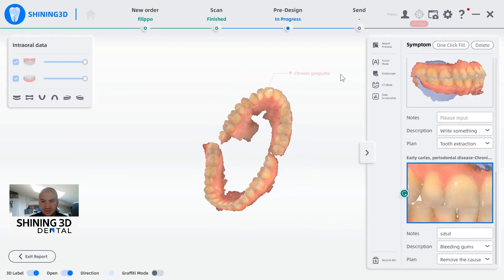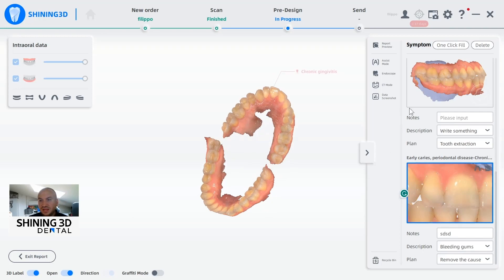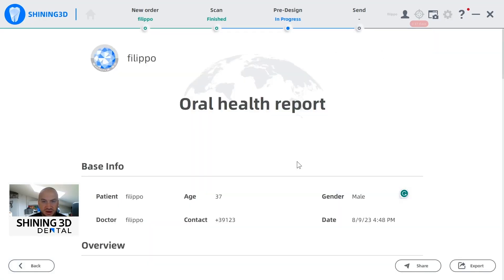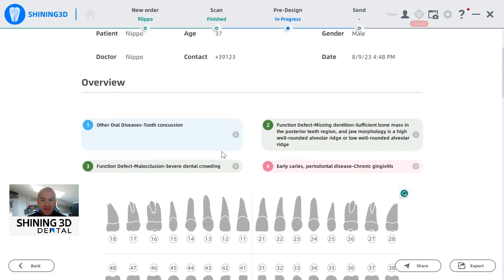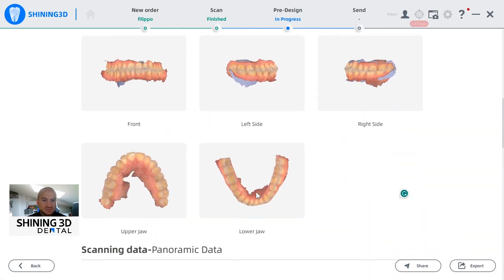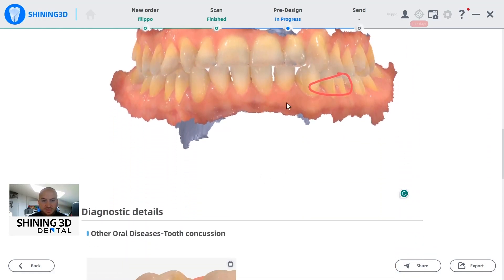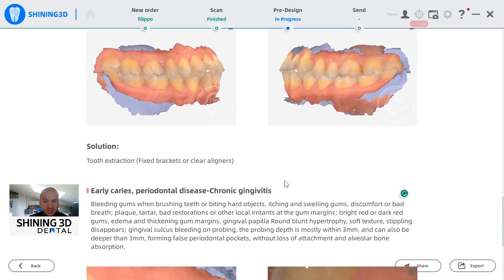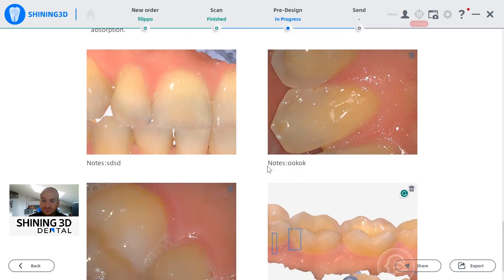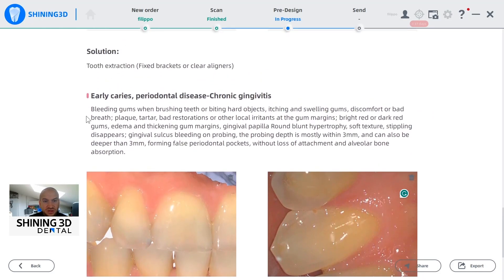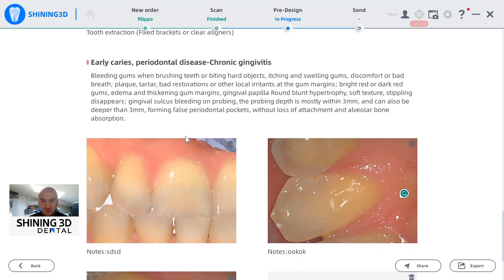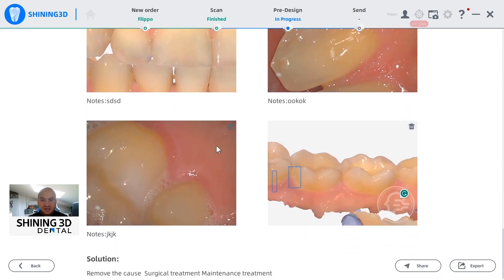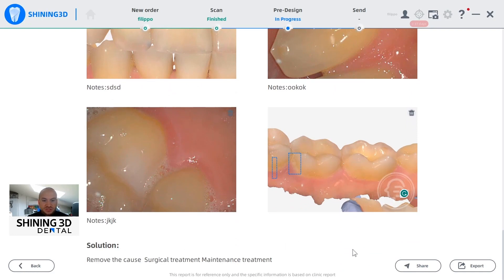As you can see, here we have the new 3D label. Once we have completed the report, we can click on the report preview. Here we have the PDF document that the doctor can share with the patient — with all the things that we marked, all the screenshots we took, and all the endoscope pictures taken in the patient's mouth. According to what we selected, we have a short description of the issue and also the possible solution. If I click on share, the software will create a QR code.